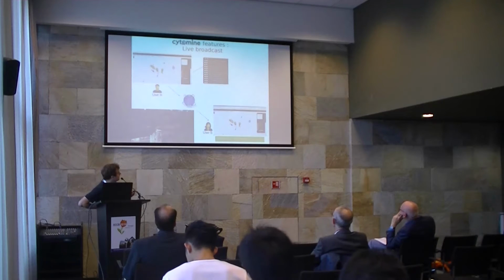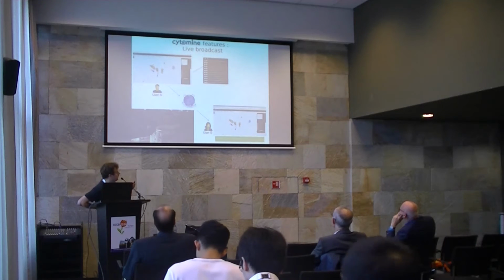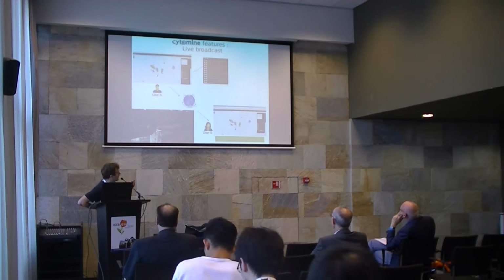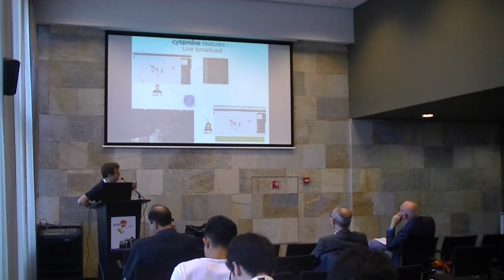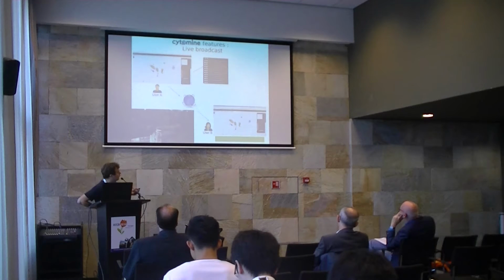Another nice feature that is appreciated by pathologists but also by other types of users is the live broadcast. So you can have one user, who I would say is the master, and you can have several other users. In this case, user A is the master, and you can have several users B that will follow user A. Each time this user is moving or drawing an annotation in an image, the information is sent to all the followers, so that the screen of the followers is also moving and displays the annotation of the user. So you can do it from anywhere in the world.